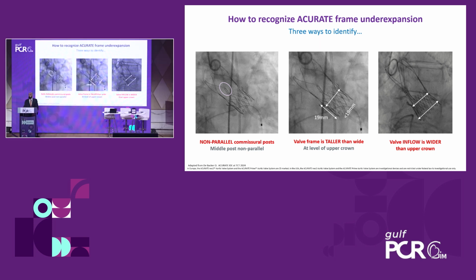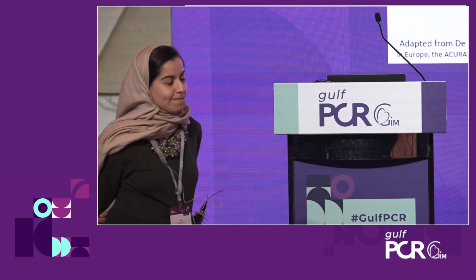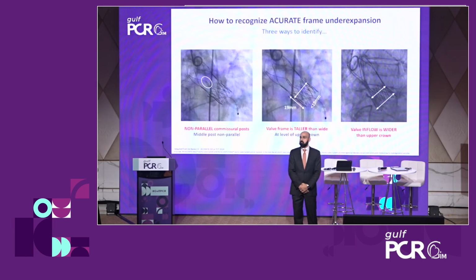How many of you have used the ACURATE neo2 platform? And from your experience, you can share with us either implantation tips and tricks or results on your patients. I think with good preparation, maybe good pre-dilation, the number of cases that you had to post-dilate is not so high, but keep in mind that changing fluoroscopy angles is important, because just assessing gradients or also echo assessment is not enough, especially in these kinds of situations. Exactly, yes.